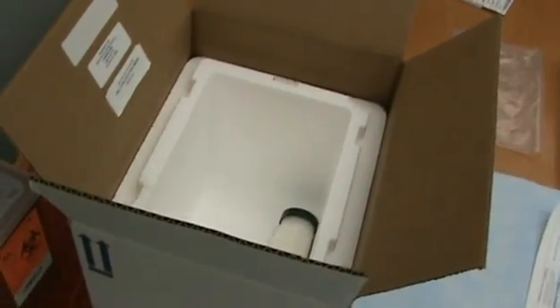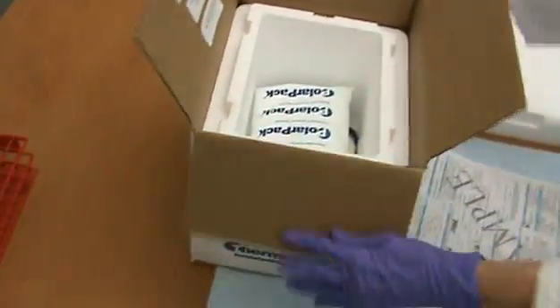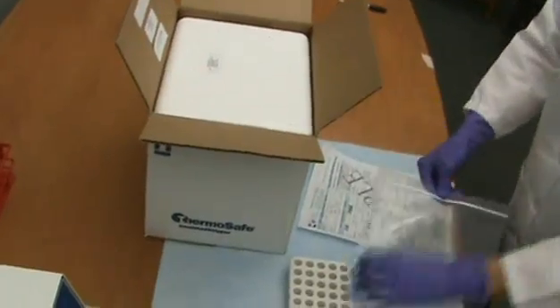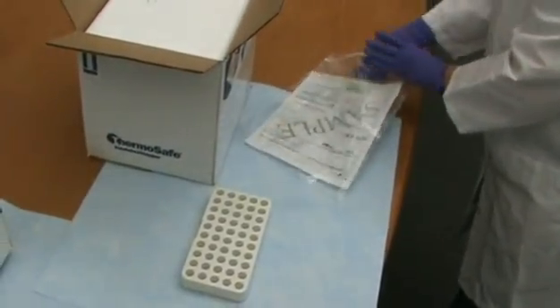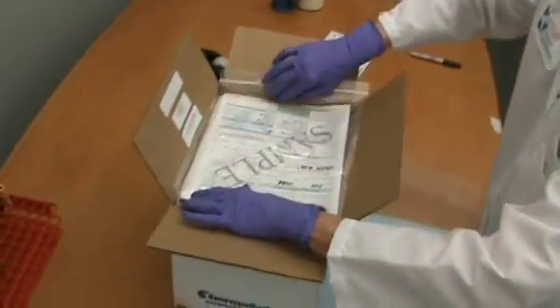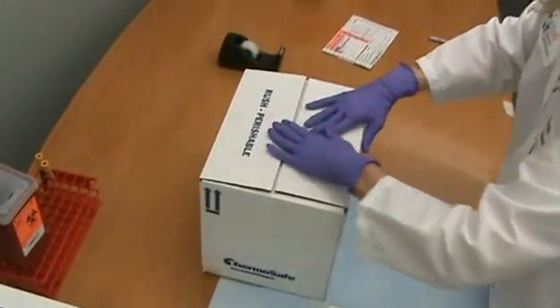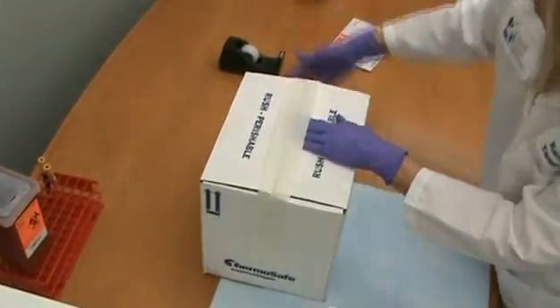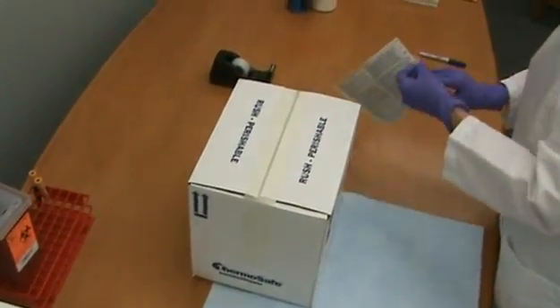Place the plastic container into the cold shipping box and add at least two cold packs. Note: cold packs must be cold or frozen before being placed into the cold shipping box. Place the styrofoam lid on the cold shipping box. Take the appropriate specimen submission forms for each specimen, place them into the plastic bag, and ensure the plastic bag is placed on top of the styrofoam lid. Close the box and secure the top with tape.